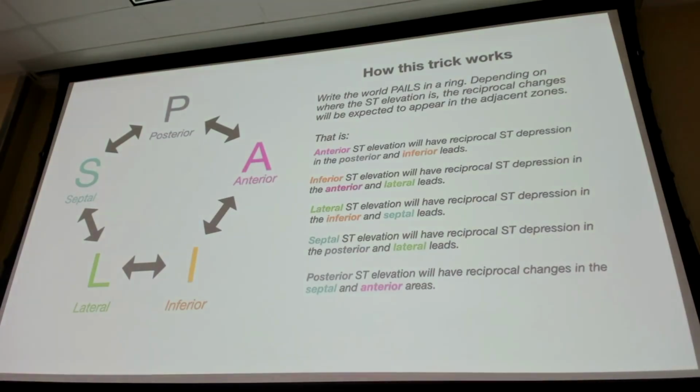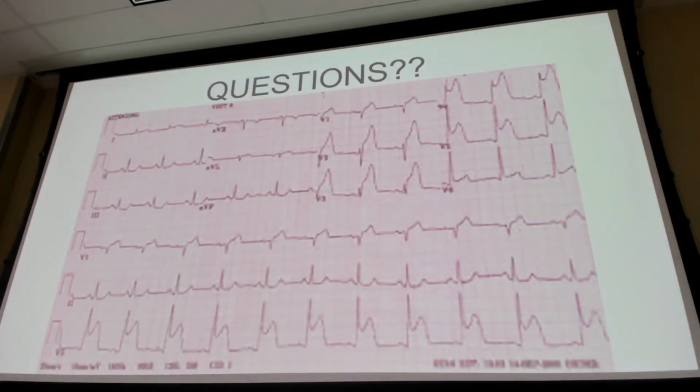Right? There's our pearls again. I won't continue beating the dead horse on this. It's important to memorize and understand this, especially with any concern for acute coronary syndrome or what you might see with a STEMI and reciprocal changes. And there's an extremely significant STEMI on there.